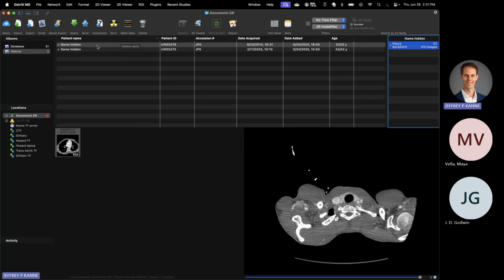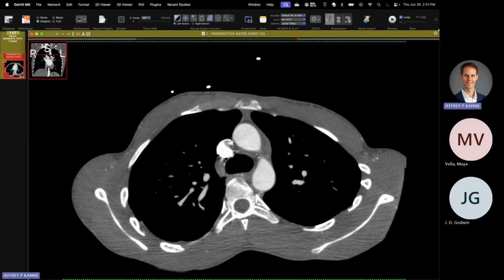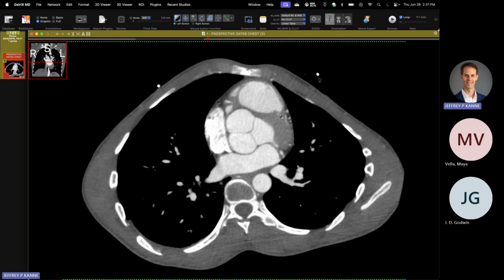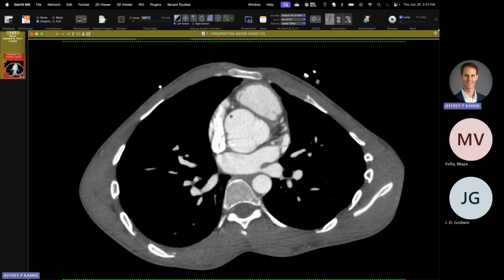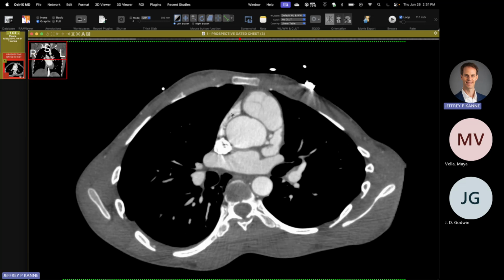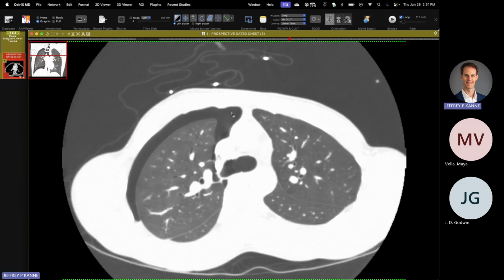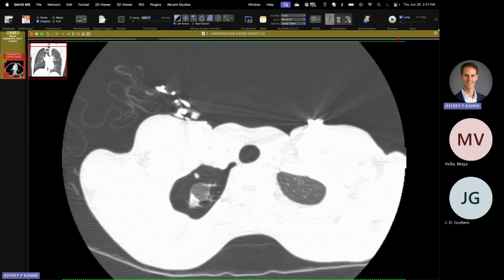have two cases this week. First one's kind of a cool case, and I won't tell the diagnosis right away, but this is a youngish person who came in with chest pain. You can see there's a funny shape to the chest. There's kind of a pectus carinatum. There's a scoliosis. The aortic root is dilated, and they were looking for an acute aortic syndrome, but instead, you see the cause of chest pain is this pneumothorax. And the reason there's a pneumothorax is these little tiny blebs of the apices here.